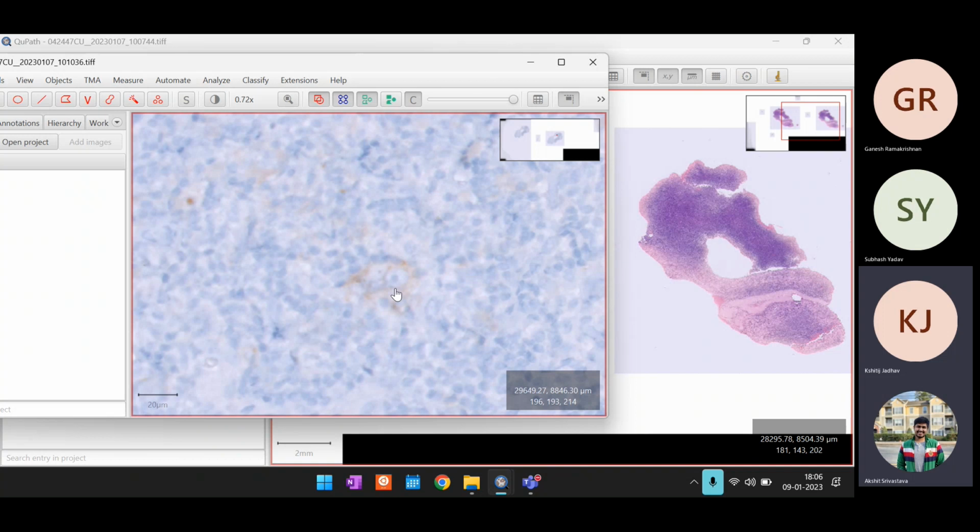From that right side image, the flipped image, you delete any information in the location of the RS cells that you have identified from the first image. Then we do unsupervised clustering on this new image. Did you get what I said? Yes, sir. Got it. Can you repeat it?